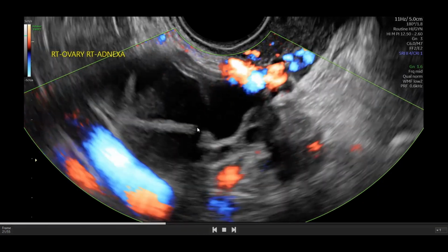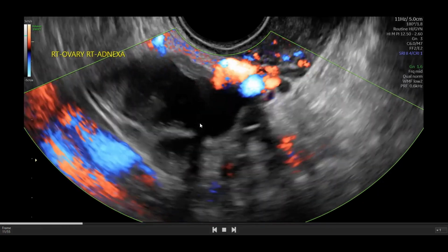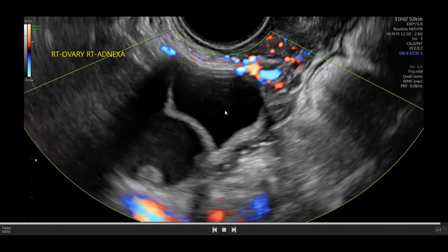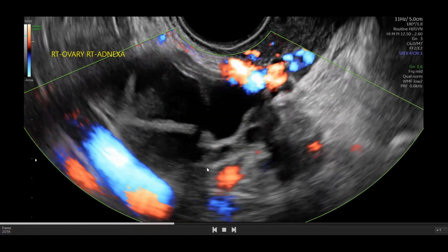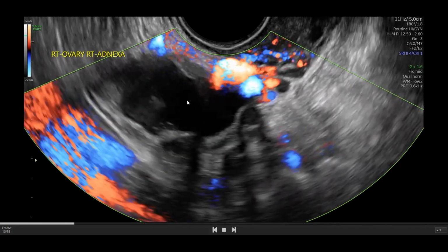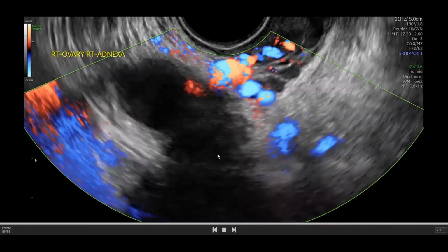And in this case, based on the very high likelihood, though in real time, sometimes it's hard to process, I don't think this would be classifiable as per simple rules, so we would be moving on to more advanced tools. The vascular flow doesn't actually matter. But in this case, I see minimal to none vascularity, so I'd score it as an IOTA score 1.